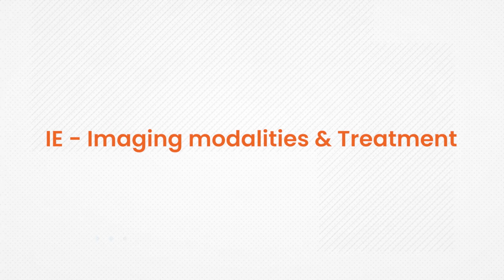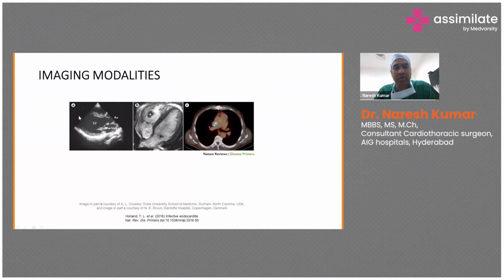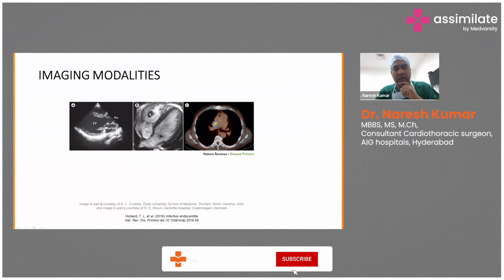Imaging modalities can be used to diagnose or confirm infective endocarditis. As I told you, the first image is a 2D echo showing a vegetation on the mitral valve leaflet. The video I showed you was an aortic valve vegetation, and this is a mitral valve vegetation.